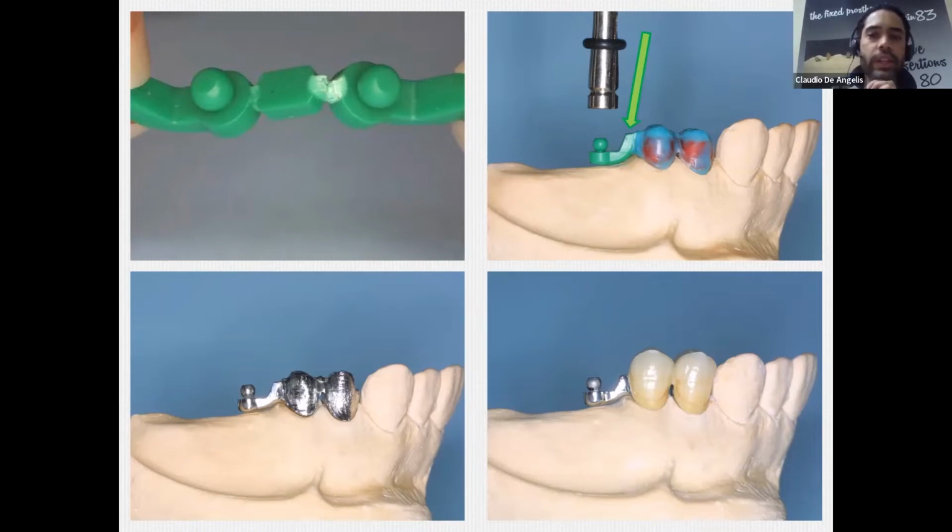I have fear that it will break or something. The biggest mistake of their life. Okay, this attachment was designed to answer some mechanical stresses, and in doing this, we do not need to modify it. So always respect this arm. I will show you why with a very interesting video.